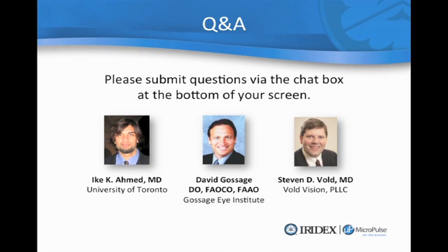and for MLT in terms of any experience using higher levels, 1,500, 2,000 milliwatts, playing around with the duty cycle. Anyone have any experience on that or thoughts on that? I do not yet. I have not tried over 1,000 milliwatts. I'm not sure yet, but I do know, at least with the cadaver studies, that 1,000 milliwatts at that time did not show any thermal damage to the trabecular meshwork. I am unsure yet at this point of using higher settings.